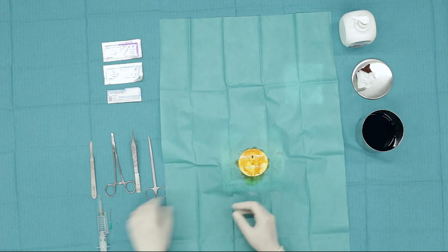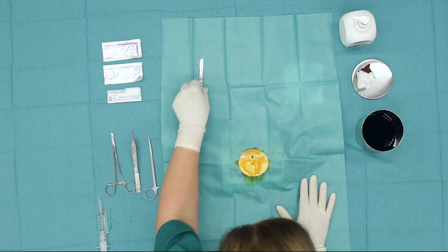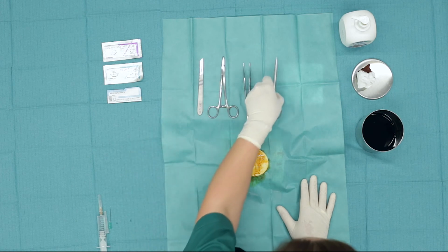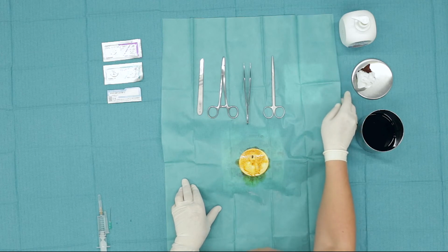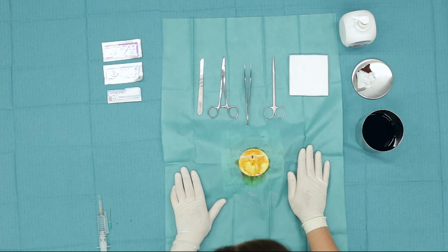During the preparation of the anesthetic, we place in the surgical field that we have created the scalpel, the needle holder, the surgical forceps, and the scissors. These are the necessary tools to proceed with the removal of the skin formation. We need sterile gauze, and we need stitches.